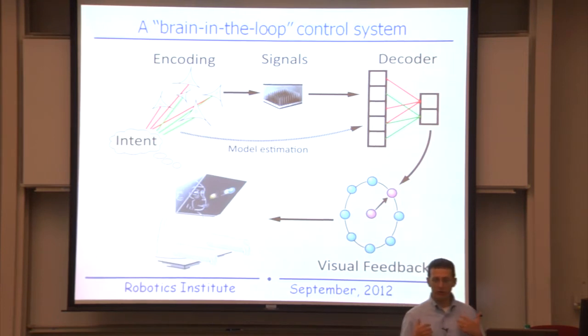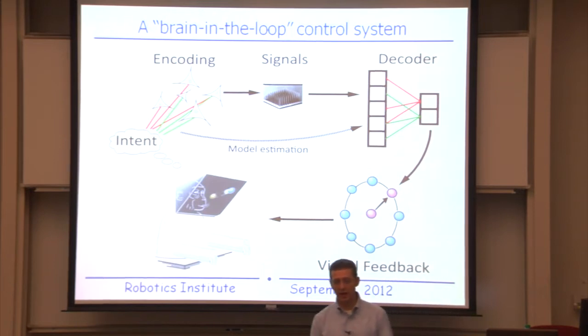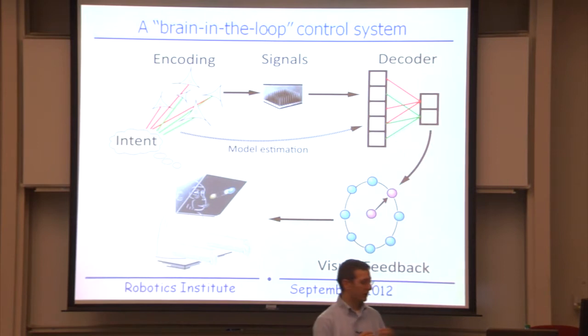And so a typical schematic of a neural prosthetic system looks something like this. You have a patient. That patient generates some kind of motor intention signal. That intention signal flows down into primary motor cortex and drives the activity of neurons in primary motor cortex. And so what we do is we record from those neurons using chronically implanted microelectrode arrays. These are typically called Utah arrays. There's 100 channels on them, and we can record from roughly about 100 neurons in primary motor cortex. And if we know how those neurons represent motor intent, we can then design a decoder to infer what that motor intent is and directly use that to drive, say, a cursor on a computer screen or a robotic arm. And then the subject sees that resultant movement and closes the loop, generates a new intent signal to try and drive that device to perform the action he's trying to do.